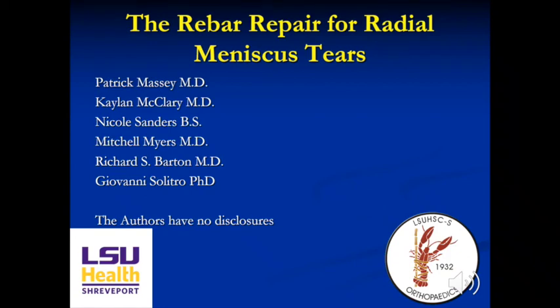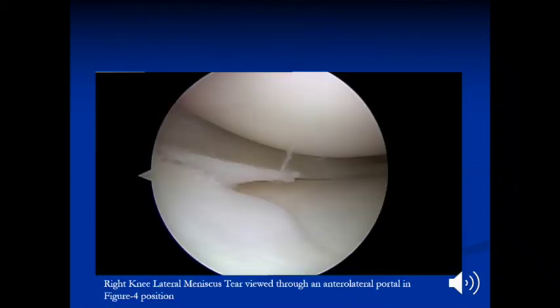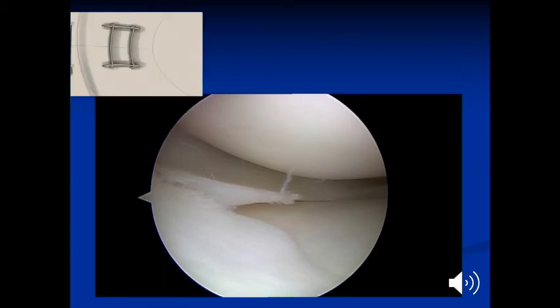This video demonstrates the rebar repair for radial meniscus tears. This is an arthroscopic view of a right knee lateral meniscus, full radial tear. Throughout this video, in the top left, there will be figures demonstrating each step of the repair.